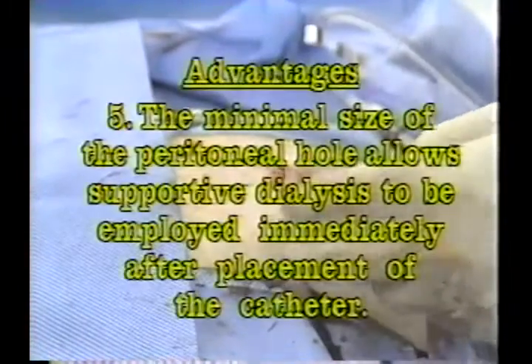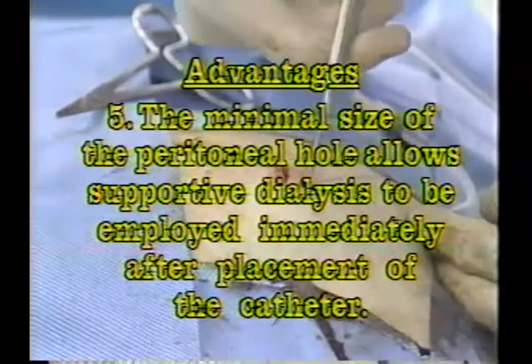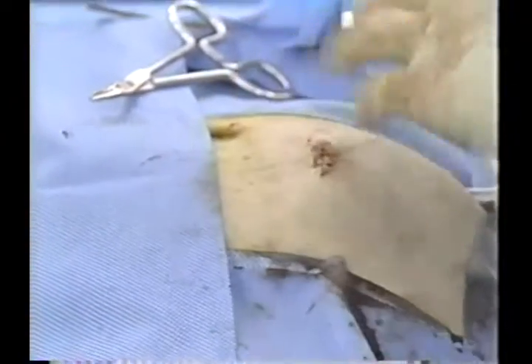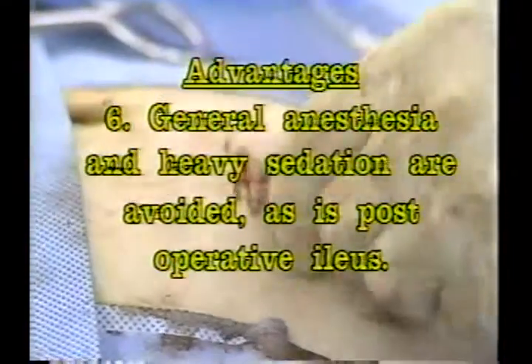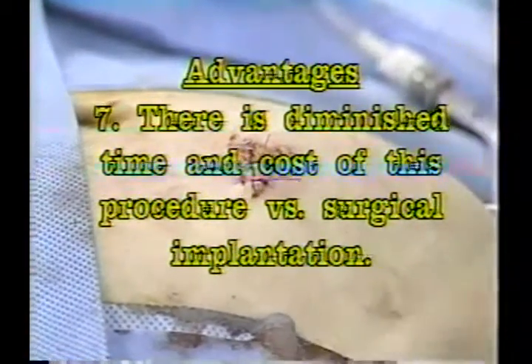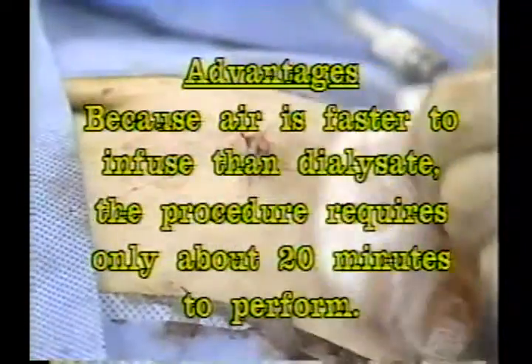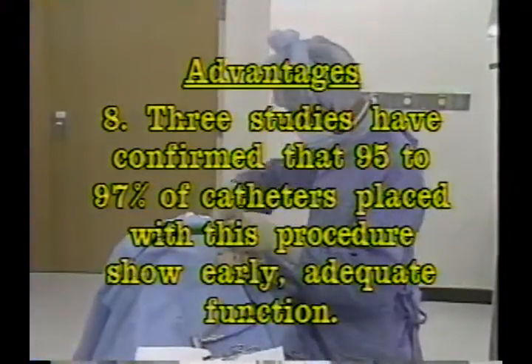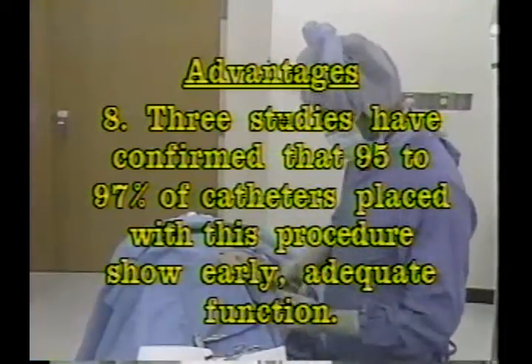The minimal size of the peritoneal hole allows supportive dialysis to be employed immediately after placement of the catheter. It is suggested to use IPD 3 times a week, or short daily CAPD exchanges for the first week. General anesthesia and heavy sedation are avoided, as is postoperative ileus. There is diminished time and cost of this procedure versus surgical implantation because air is faster to infuse than dialysate. The procedure requires only about 20 minutes to perform. 3 studies have confirmed that 95 to 97% of catheters placed with this procedure show early adequate function.